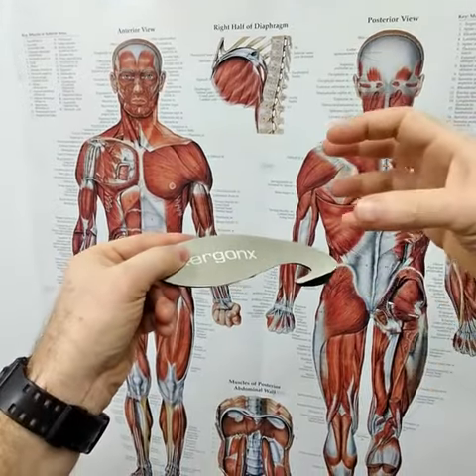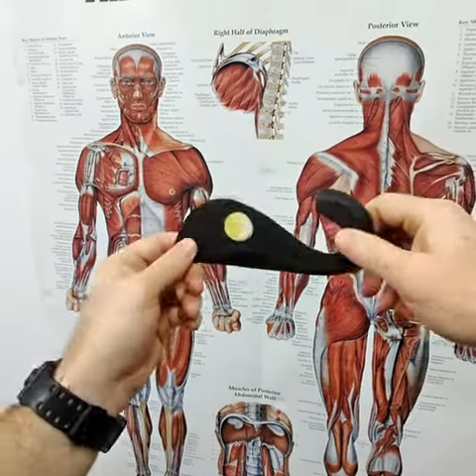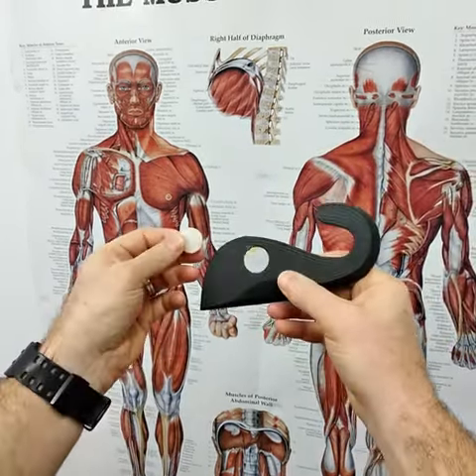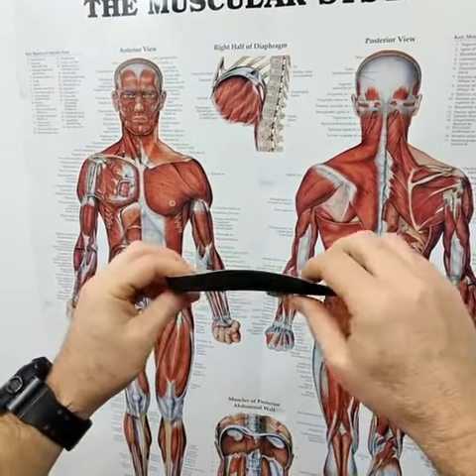It's got this deep heel cup that keeps the foot's natural fatty pad beneath the heel and helps to cushion the high impact area of the heel. And there's a Velcro edition so it can stick firmly in the shoes. That's the Ergonix Slimline.